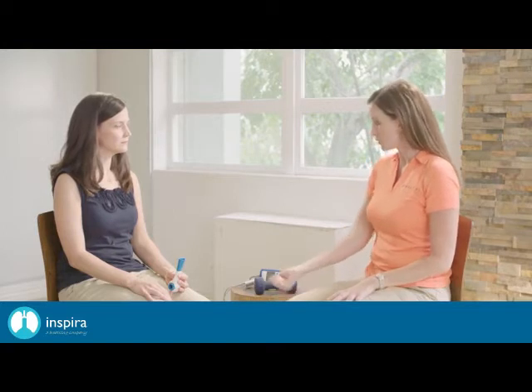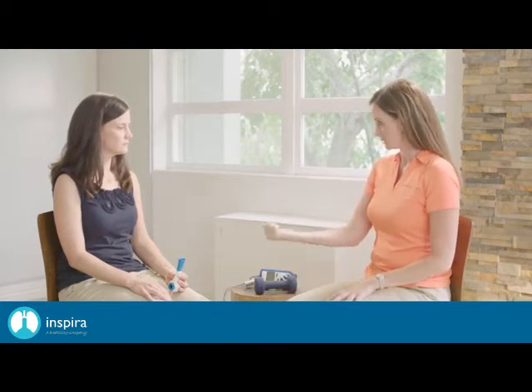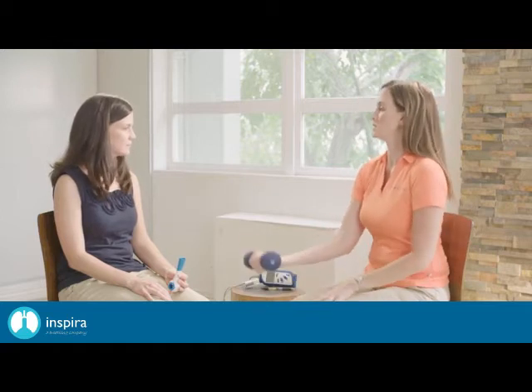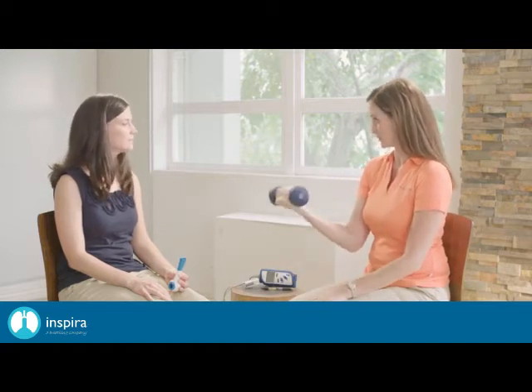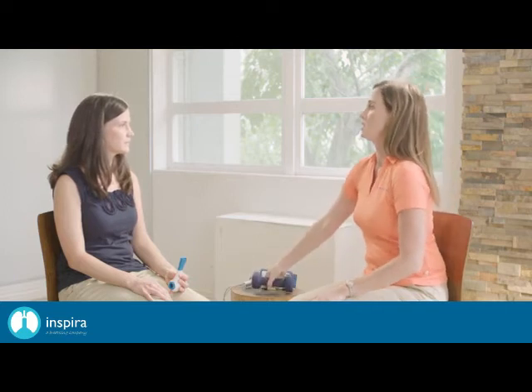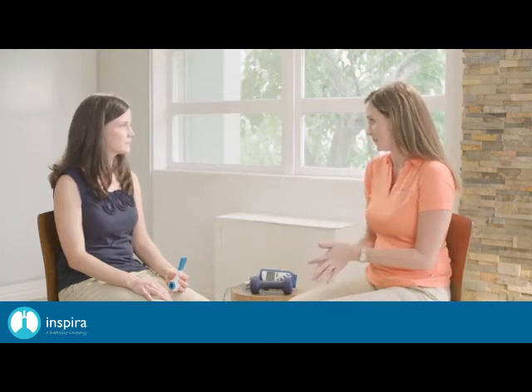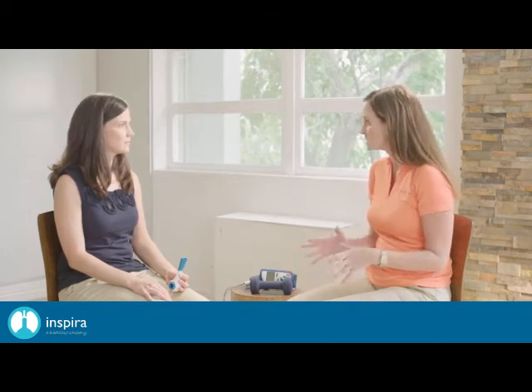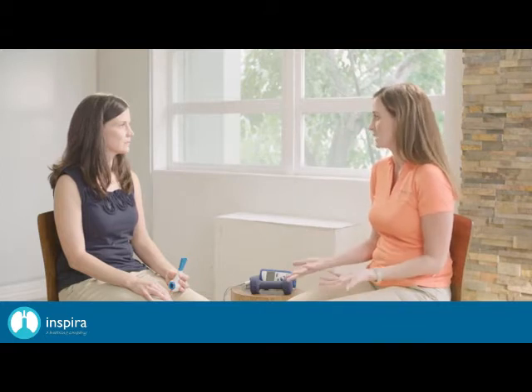So if you move your arm like this, you see I'm using these muscles. But if I add some weight, now my muscles have to work even harder, right? Okay, so this is resistance strengthening. The Breather device allows us to do resistance strengthening to the muscles of respiration. So the dial has resistance settings, inhale and exhale. We're going to start at the lowest setting for both.